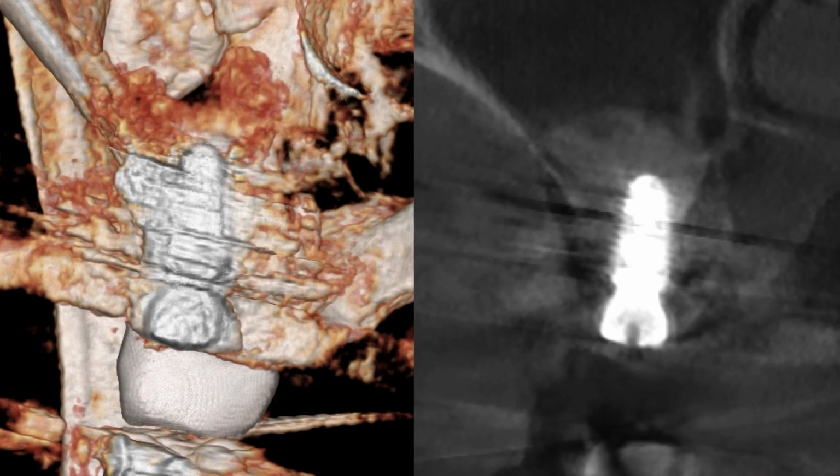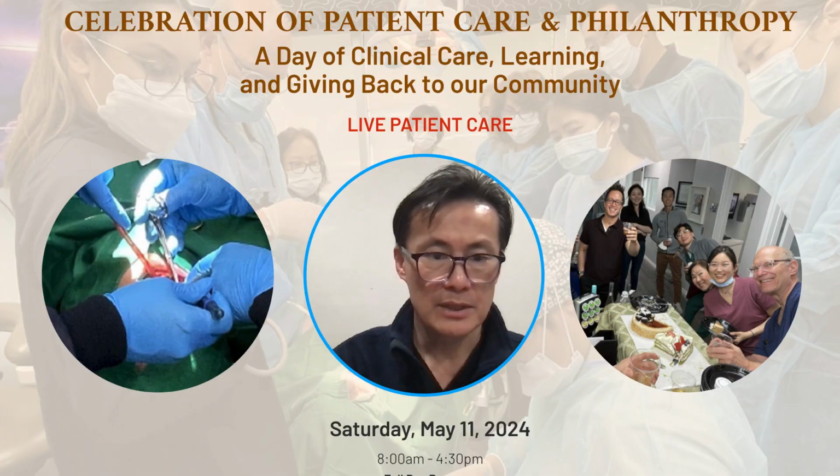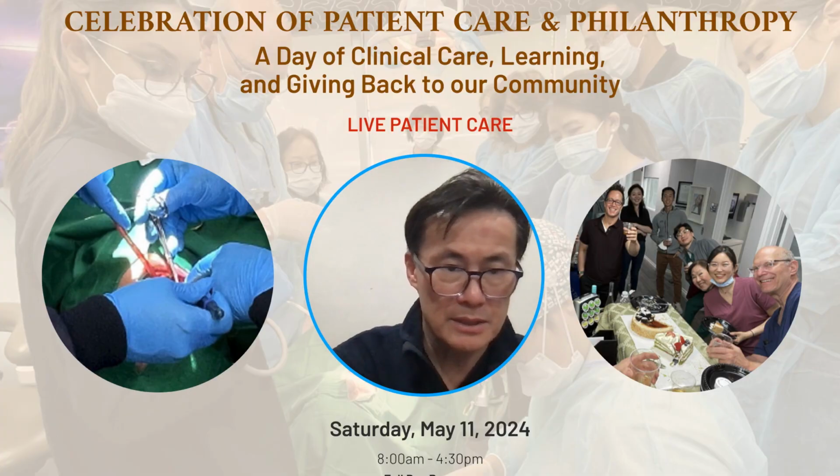Somewhere there you can kind of make out the replaceable bone window, not very clearly, and this is, of course, the most posterior one. Implant is well centered, and the bone seems to have a very smooth outline, consistent, and very, very well bound.